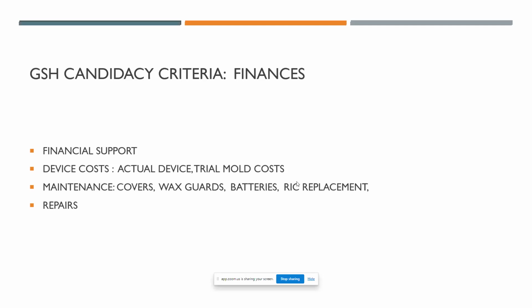And when we're looking at the device costs for the devices that we have here, I'm going to speak particularly to the bone bridge and the transcranial hearing aids. Starting off with the bone bridge, the cost of the processor itself is 50,000 rands. So the hospital has a classification for the patients. You are either classed as H0, H1, H2, H3, and private. H0, you don't usually pay for any of the services that are being offered, as well as the assistive devices. H1, you pay 10%, H2, you pay 20% of the assistive devices, so of the actual cost of the device. So you need to be thinking, is this a person that will be able to afford 10% of 50,000 rands, should that bill be sent to them if they are fitted with this device?